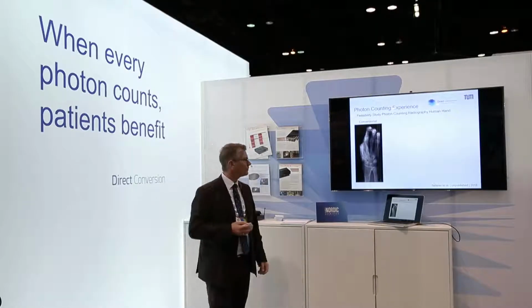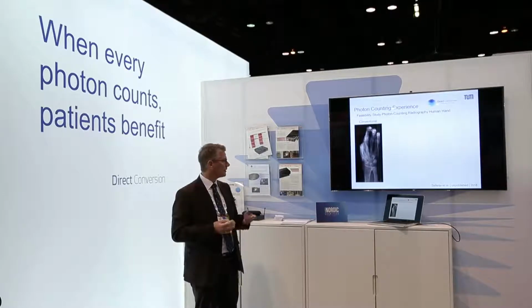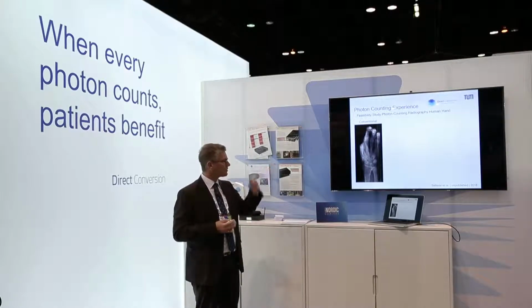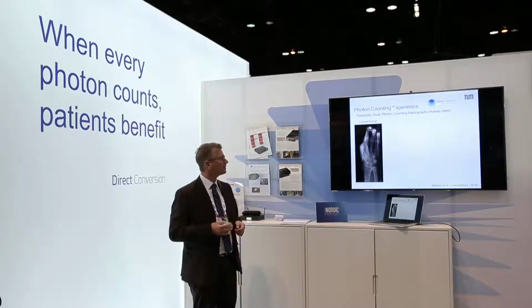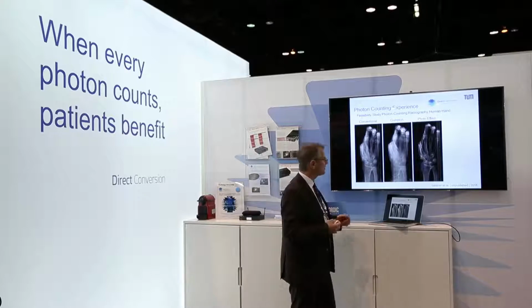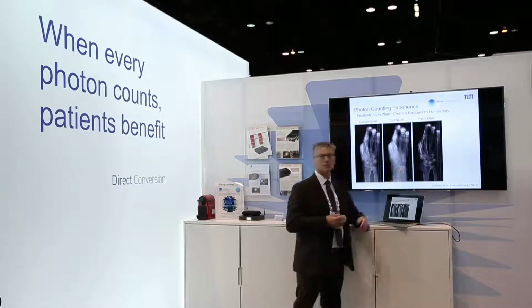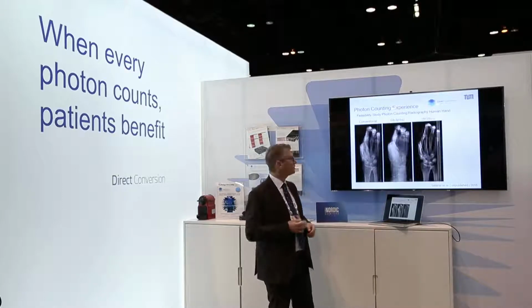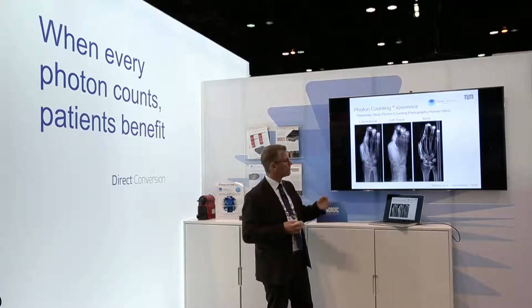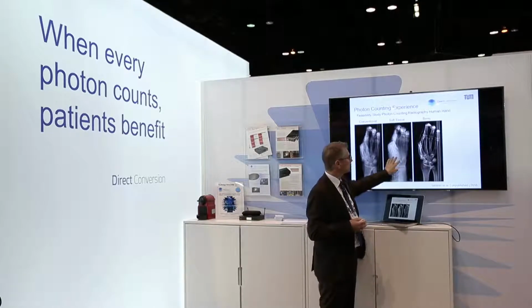We also looked at some biomedical sample. This is actually a human hand ex vivo, and of course conventional radiograph, and you can process now, as I said, with the dual energy information from the photon counting detector, the Compton, the photo effect, that you can convert into the different basis materials, soft tissue and bone. So now you have actually the bone completely separated and the soft tissue.